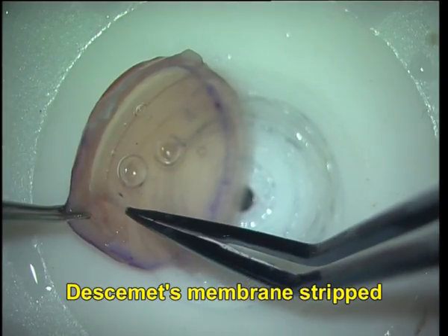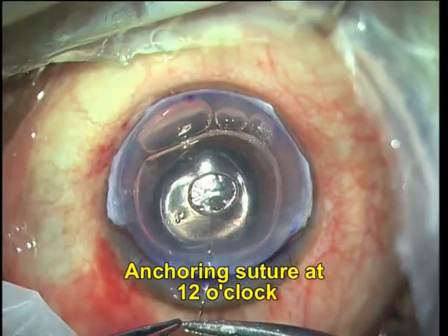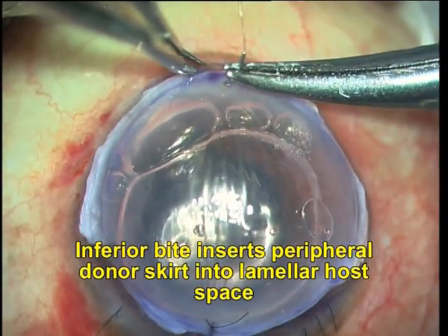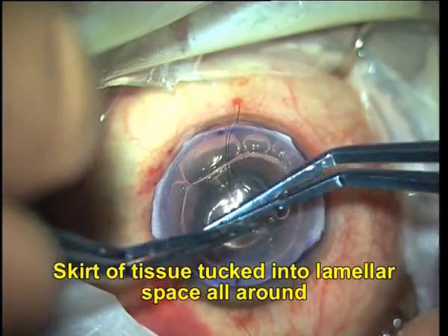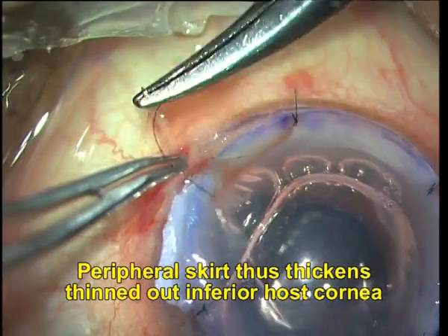What I am doing now is stripping the Descemet's membrane off the donor graft, and once that is done, I put an anchoring suture at 12 o'clock to anchor the graft to the host cornea. The inferior bite inserts the peripheral donor skirt into the lamellar host space, and you can see that I take a deep bite which allows the peripheral skirt of tissue to be tucked into the lamellar space originally created in the host cornea.